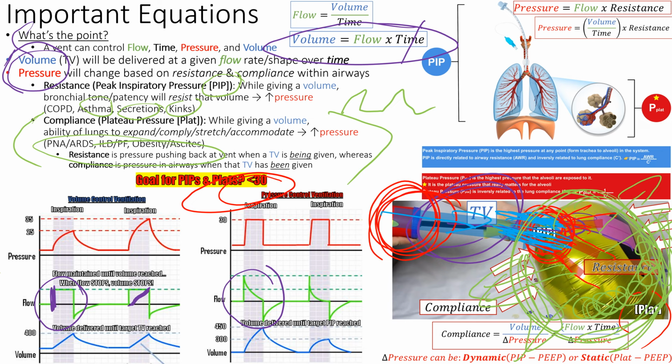Yes, it's going to raise the PIPs, but I can put what's called an inspiratory hold on the patient and say, hey, I know the pressure's high, but what happens when I pause it and see what all the pressures are once everything equilibrates? So you can look at the difference in the pressures, which we'll point out.